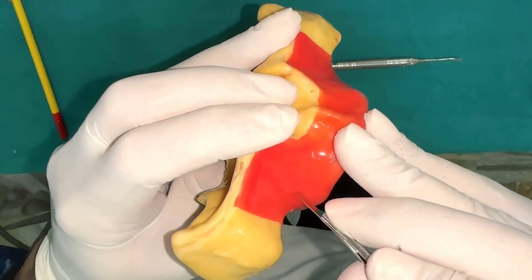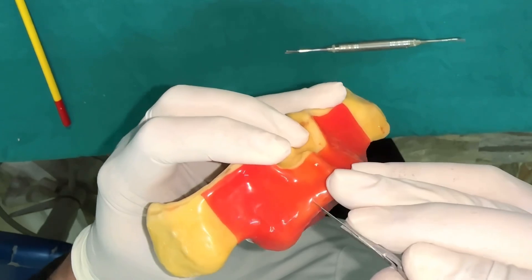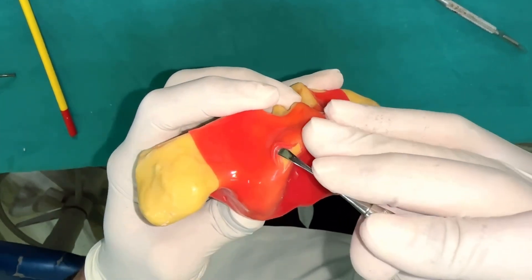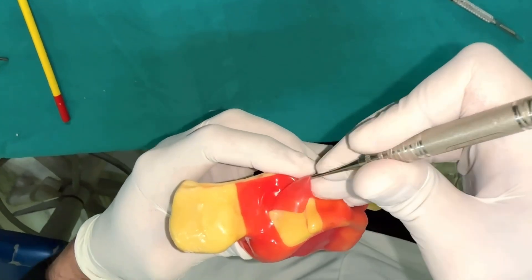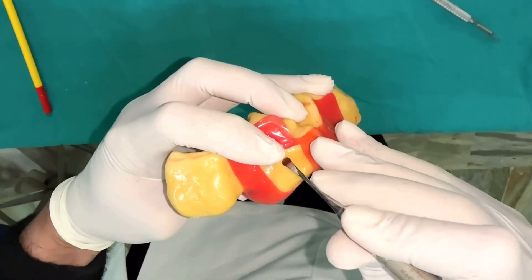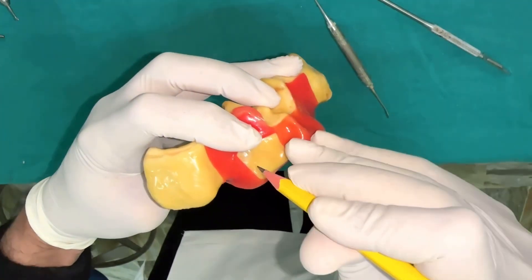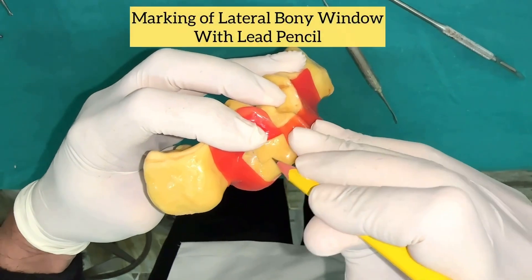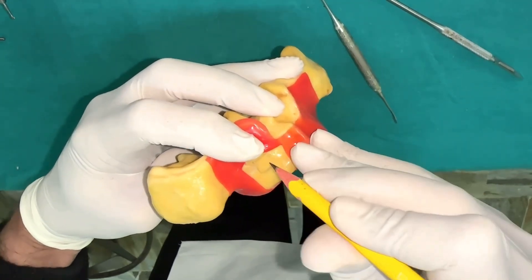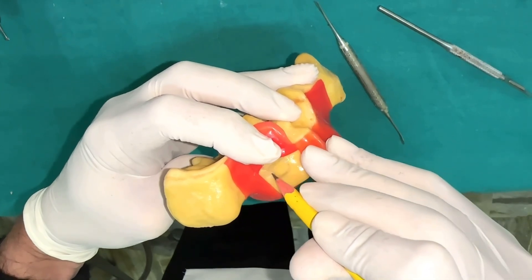There is a sort of Teflon coating — some kind of polymer on this model — and we have to reflect it. Once those incisions are complete, we use the periosteal elevator. This is the similar reflection as we have to do in the patient's mouth. Once this is done, this is the rough site in which we have to do the augmentation. In this we have to prepare a window; for that, in the patient we can use a normal lead pencil to mark it. These are the approximate dimensions of the window that we have to cut in the patient's mouth from a direct sinus lift point of view.